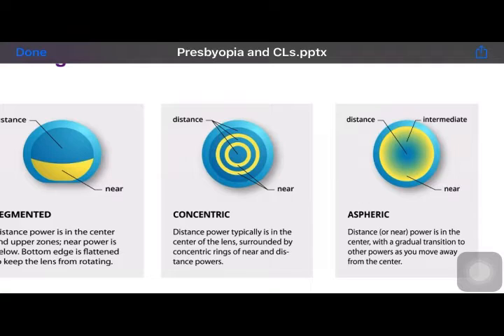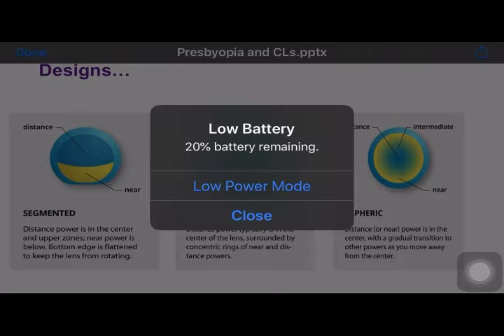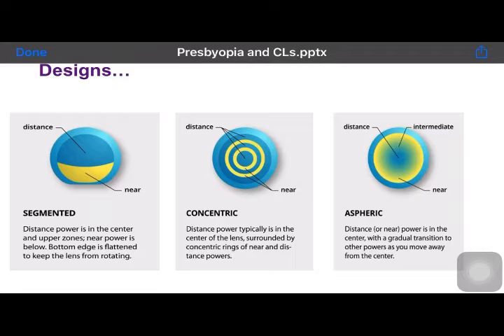So whenever you hear this term aspheric design, it is actually a true multifocal design where you have the distance, you have the intermediate, as well as the near zone. So all of these three zones are present in the patient's eyes and they can see that. So the oldest design was segmented, then you got the concentric design, and the latest design that you get, including those in IOL, RGPs, soft contact lenses, scleral lenses, is the aspheric design, which has a distance, an intermediate, and a near zone. Now, based on manufacturers, it can either be a center distance or center near in design, but you get the latest design as aspheric design for your practice.